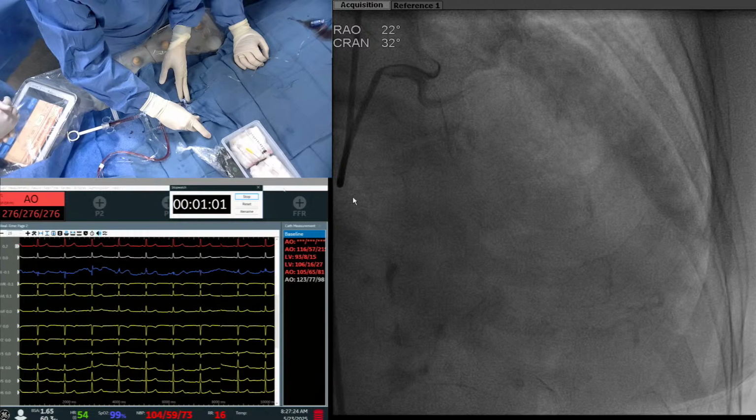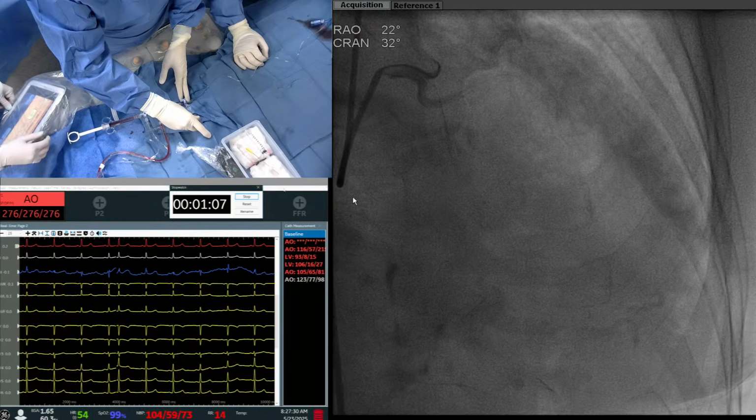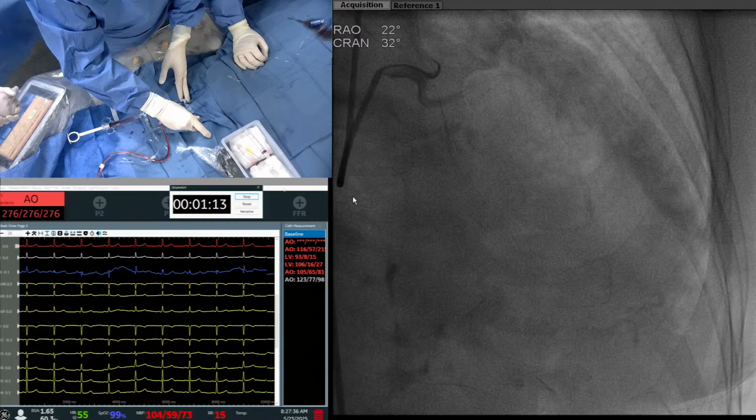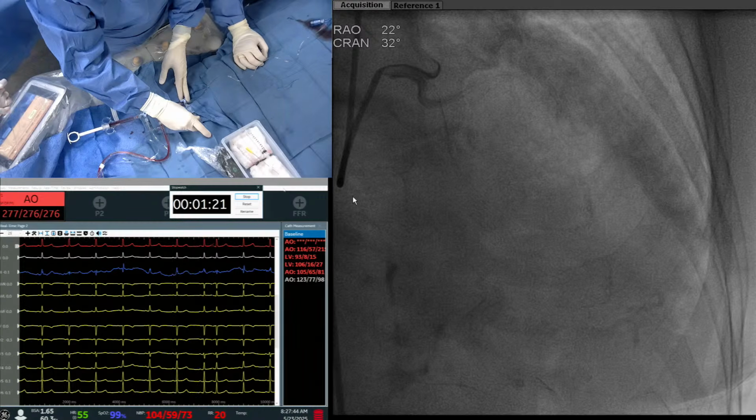And also the patient may tell you that she's starting to have symptoms. With a 20 it is unusual, but I had a case actually with non-obstructive mid-LAD that developed a severe spasm with the 20. And you can even have slow flow. So you have to be very meticulous on these.